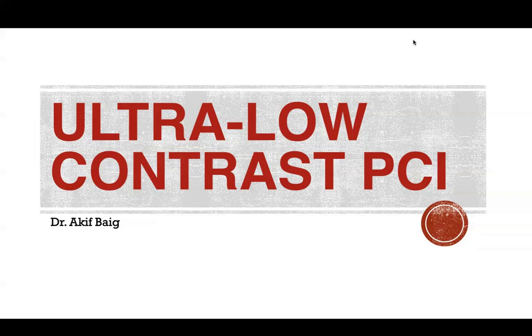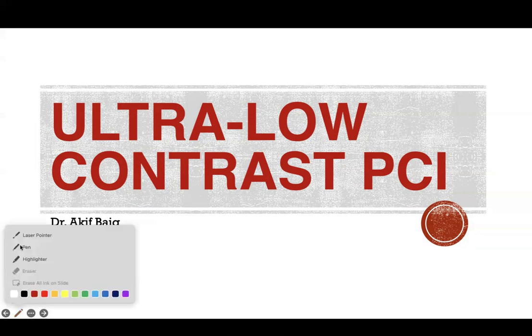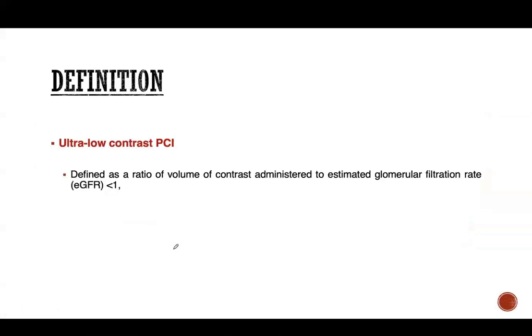Today we will be talking about ultra low contrast PCI. Ultra low contrast PCI is defined as when, during a percutaneous coronary intervention, the ratio of the contrast volume to the eGFR is less than 1, then it is called ultra low contrast PCI.